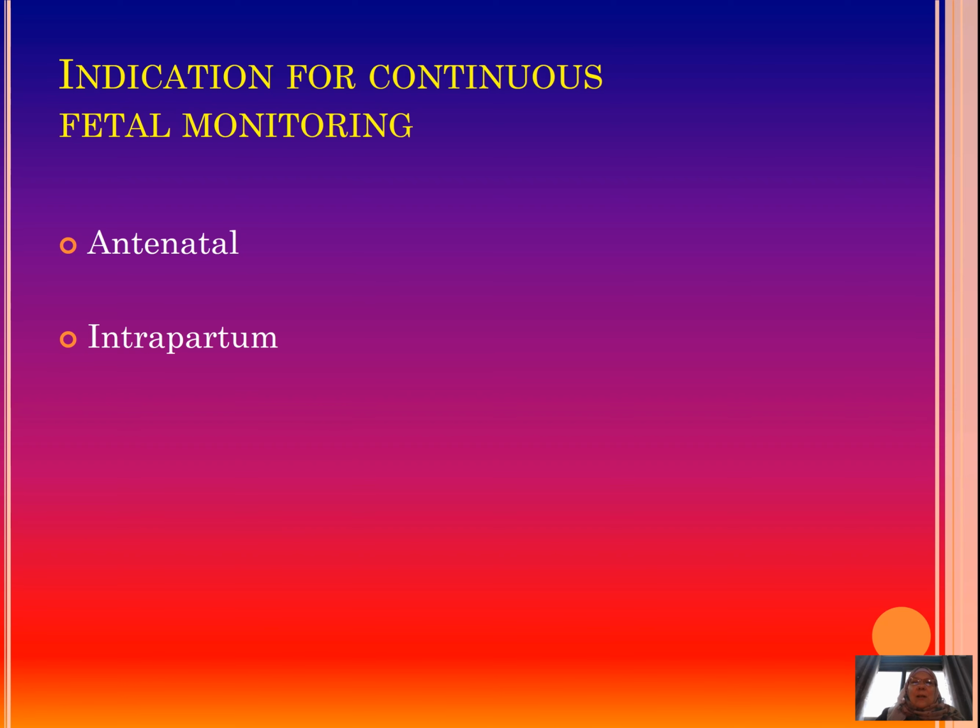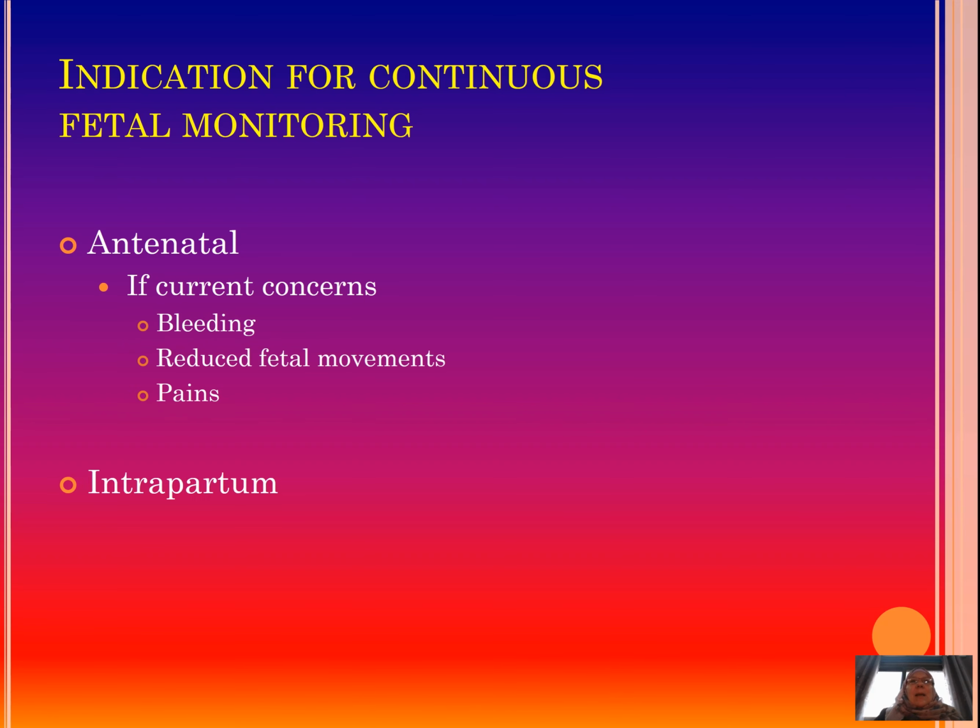Just jot down 3 indications for both, please. Antenatally, you use a CTG whenever you're concerned about the fetal well-being, but especially when there's bleeding, reduced fetal movements or pain.